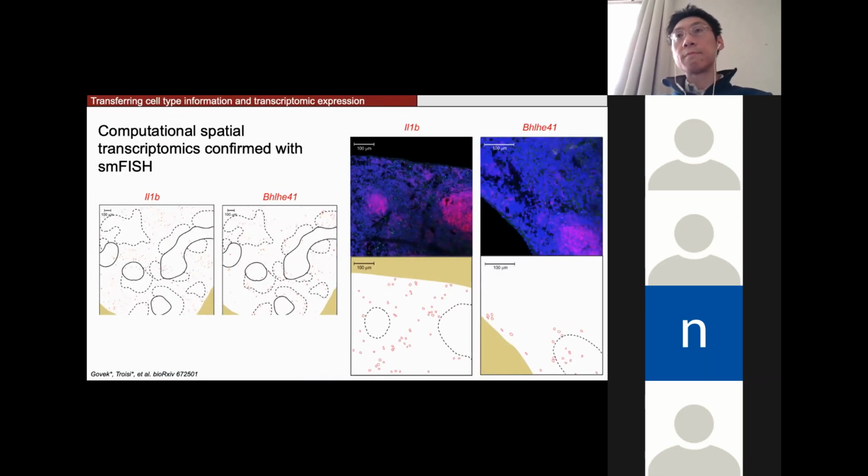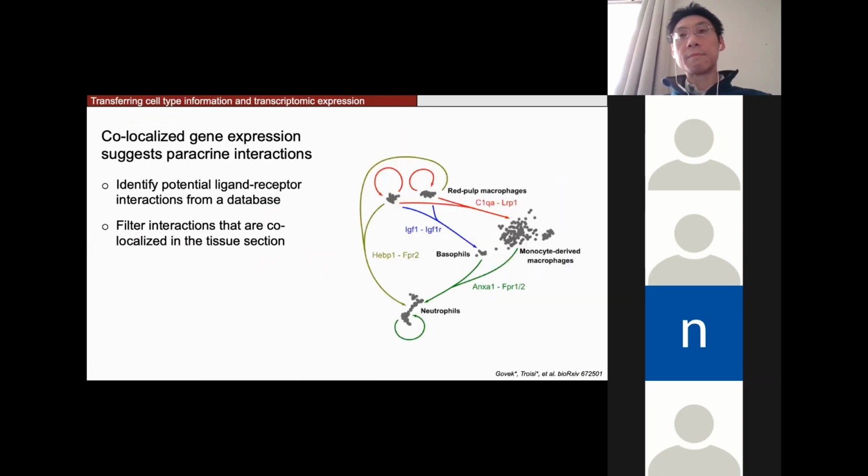I would say irregular and unknown. In a lot of our analyses, we're looking at which cells tend to be close to each other in a tissue section. If we don't have enough cells infected, then there's not much we can do to compute the significance of that, if there's not enough for the statistics.